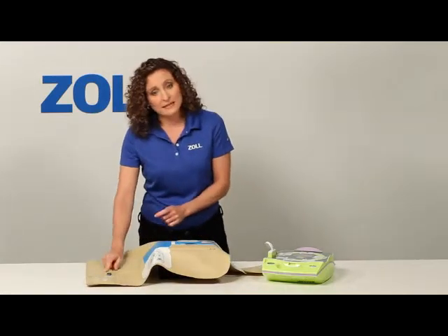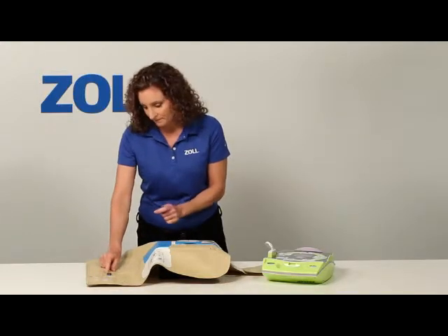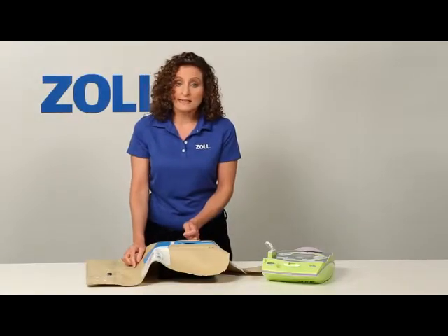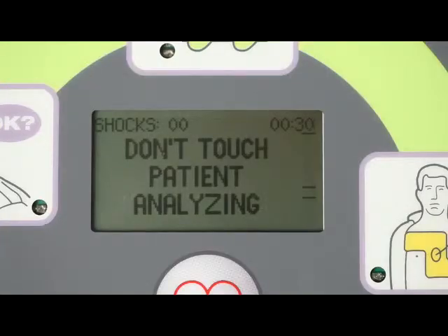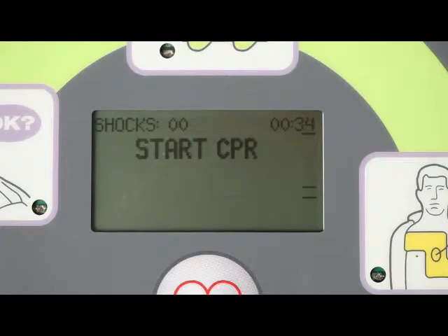I will set the simulator to present asystole, an unshockable rhythm. Don't touch patient. Analyzing. The AED Plus recognizes the presence of a heart rhythm and begins analyzing it. No shock advised. Start CPR.